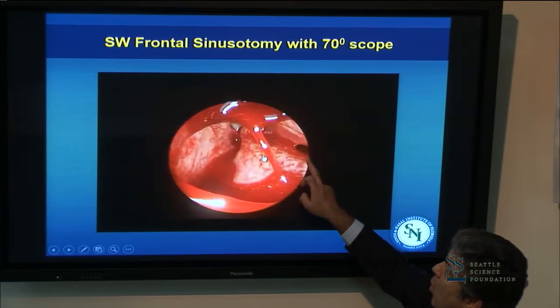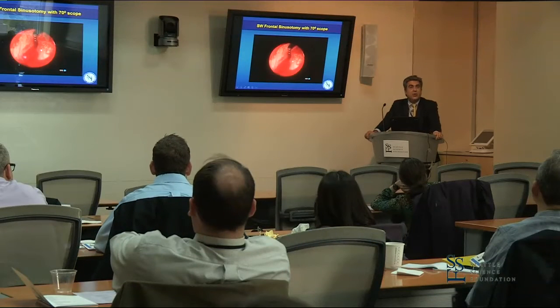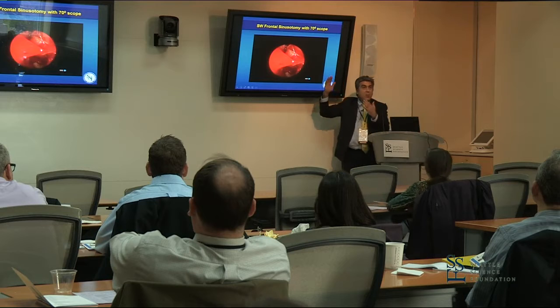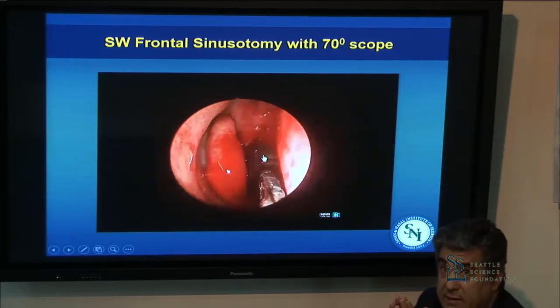This is the medial lamella. There's a frontal recess, and it's right next to the middle turbinate. I'm going up right next to the cribriform plate — it's the scariest, most dangerous place to be — but I defined in my mind where it was on the imaging and was able to localize it again with image guidance.